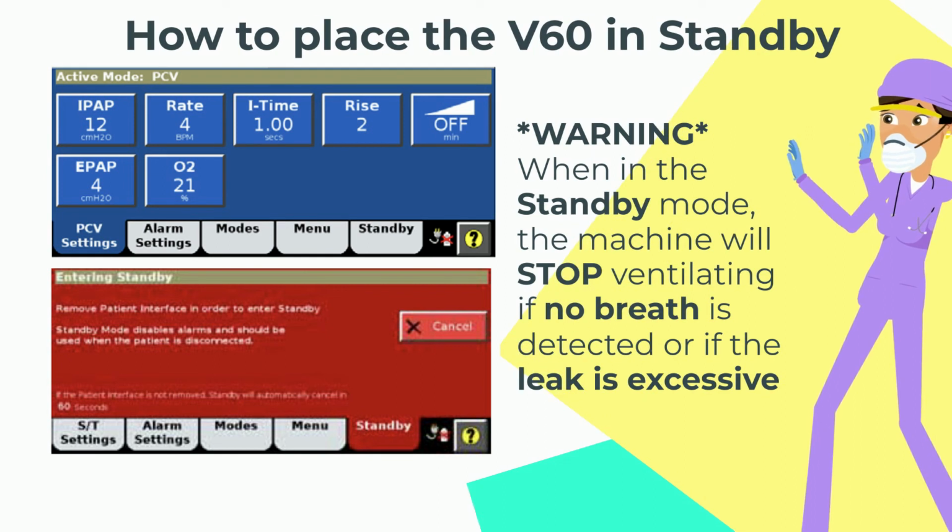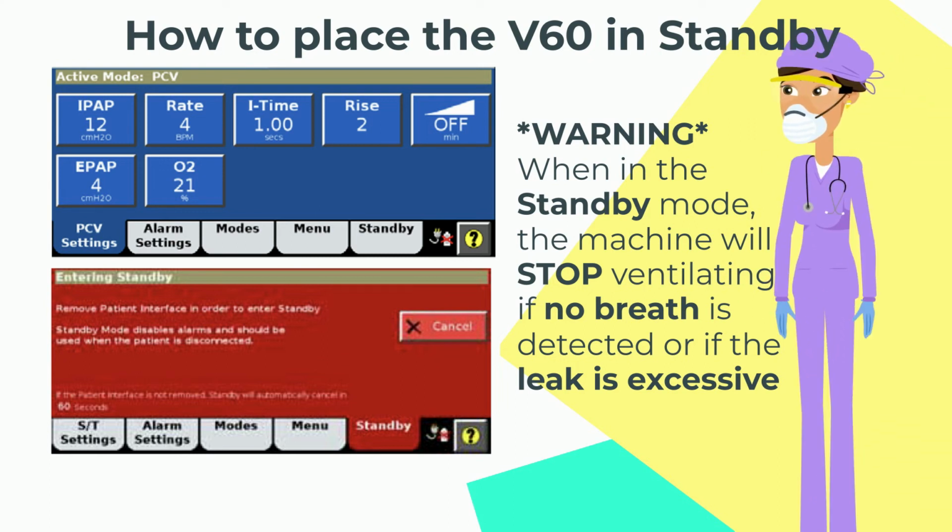Warning: when in the standby mode, the BiPAP machine will stop ventilating if no breath is detected or if the leak is excessive. So please only utilize the standby mode if you are removing your patient and placing them on another supplemental device or if they're stable enough to remain off of BiPAP.